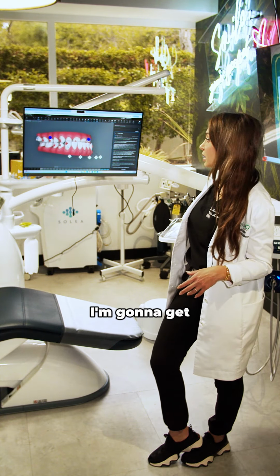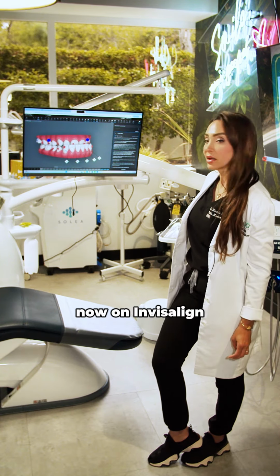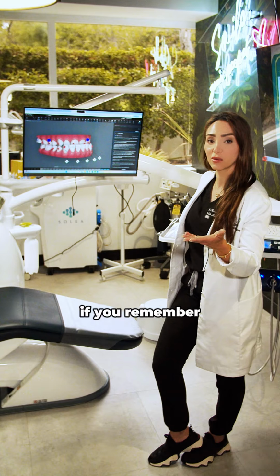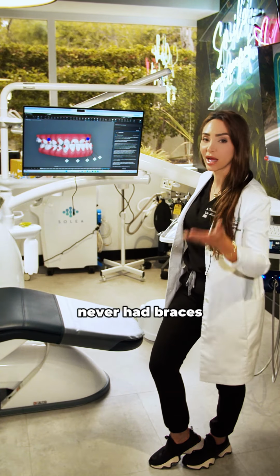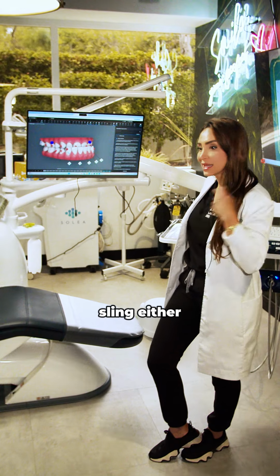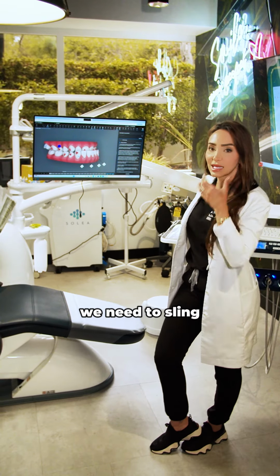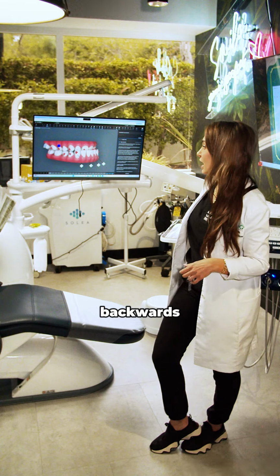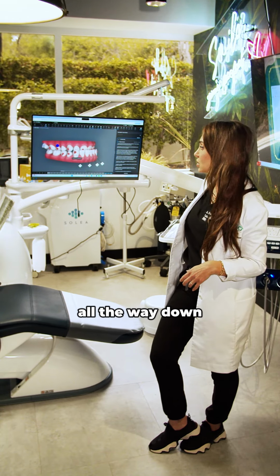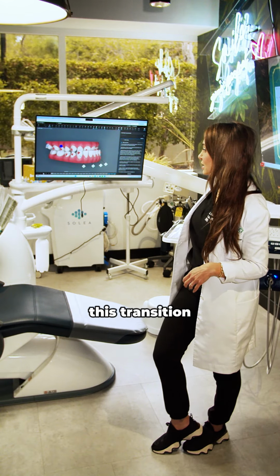But you can see here, I'm gonna get really in depth, there is an underbite. Now on Invisalign, we do also have bands. Just like if you remember some people growing up, if you've never had braces, you might have seen people with rubber bands in their mouth. It's to sling either the teeth back or sometimes even forward. So in this case, we need to sling the bottom teeth backwards. And so we attach bands from the upper molar all the way down to the bottom. And you can slowly start to see this transition.